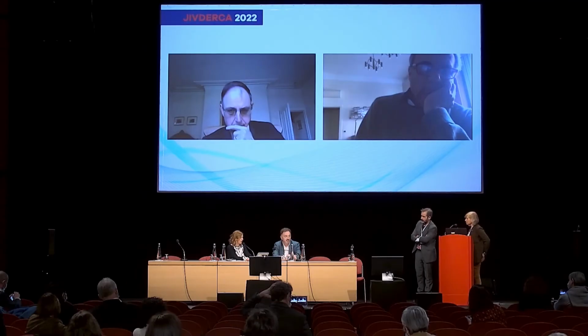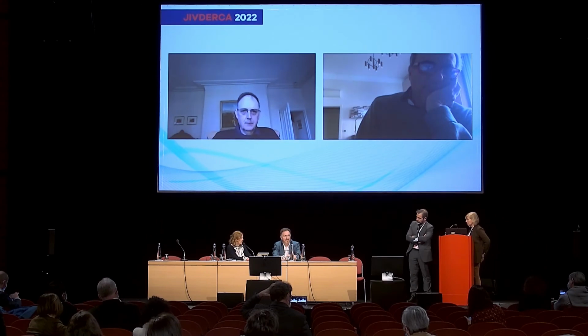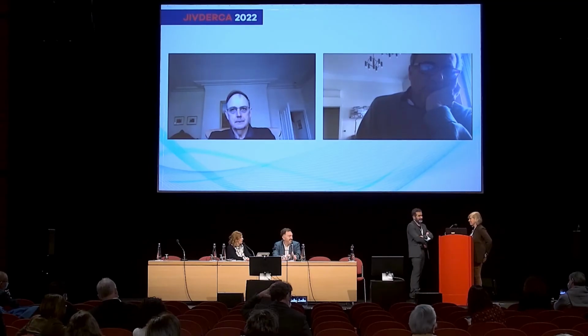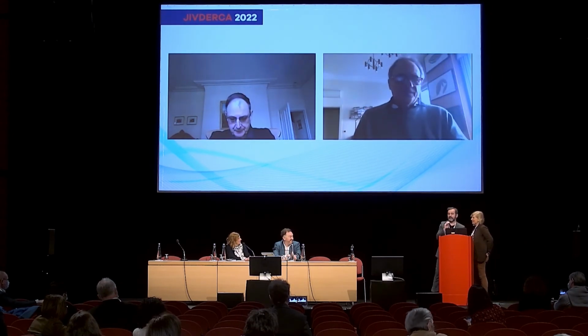And Gerhard has a second question that he'd like us to ask on his behalf. Isn't high-intensity NIV, with big differences between EPAP and IPAP, sending a high flow during inspiration? Yes, of course, it's a very high flow, and what we could recommend, and we work on that, is something I've been trying to convince the manufacturers of.